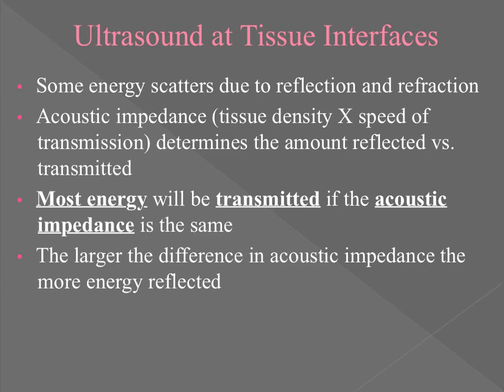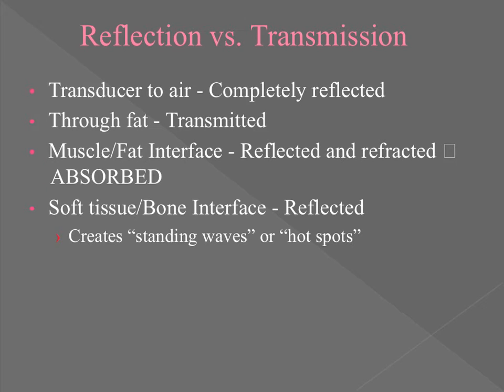And so what we know about tissue densities and acoustic impedance is that the larger the difference in acoustic impedance, the more energy that's going to be reflected. So the more that we can reduce that impedance, the more that we can improve our treatment area, the more likely we are to see the clinical benefit or utility of using therapeutic ultrasound.